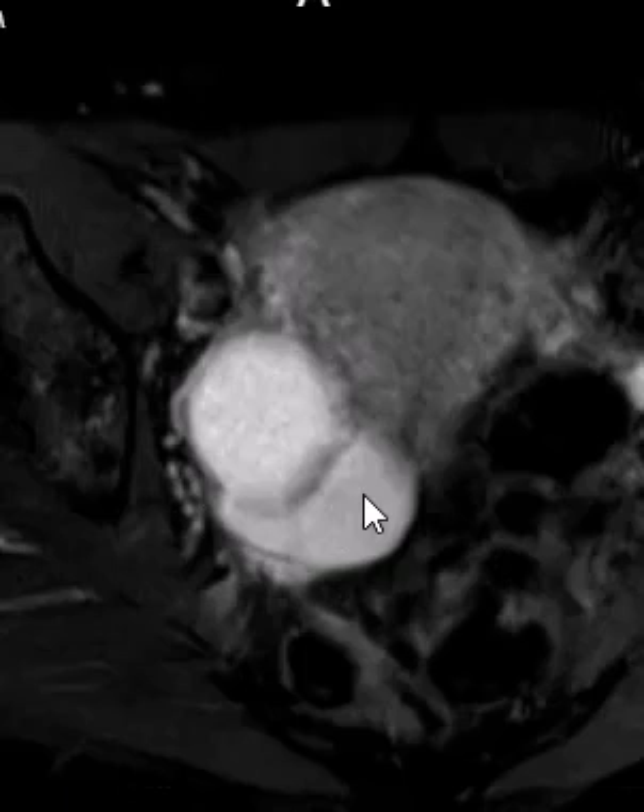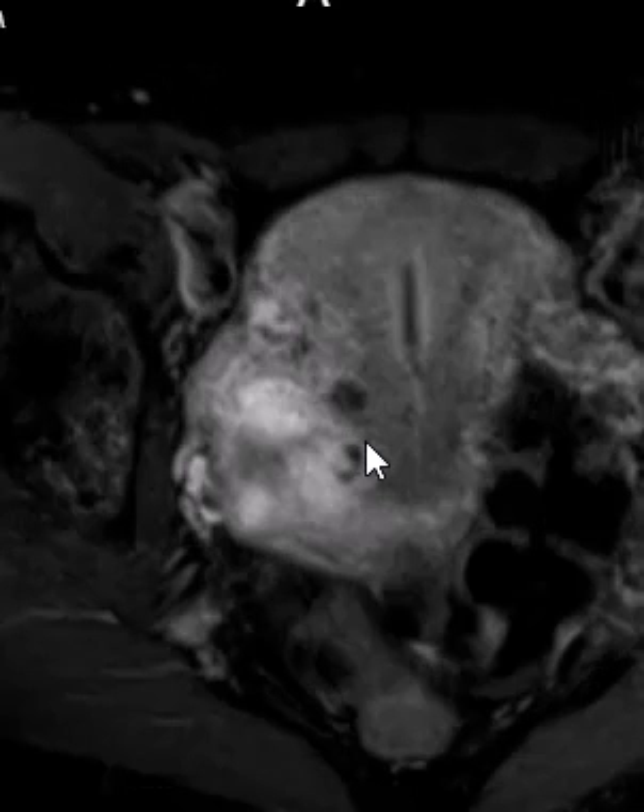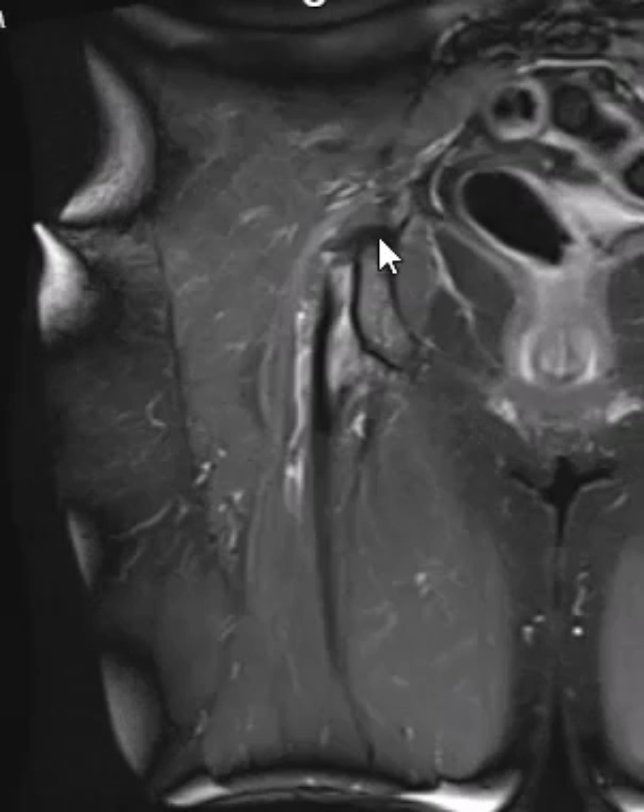One last final look at these two adjacent fluid collections — this is the one that was hyperintense on T1. There is another small uterine fibroid here, the IUD is visible in the central uterus. That concludes this case of a hamstring tendon tear, and I thank you very much.